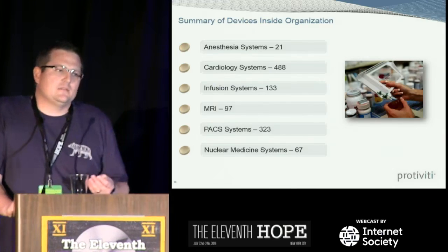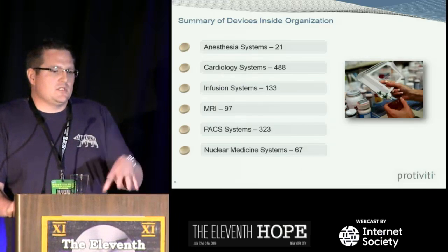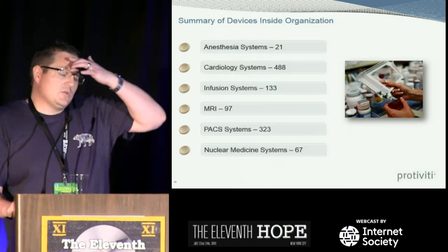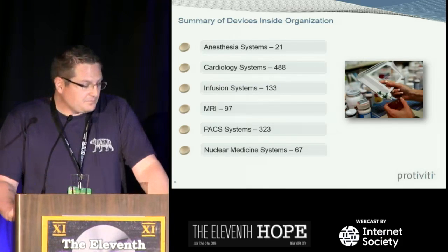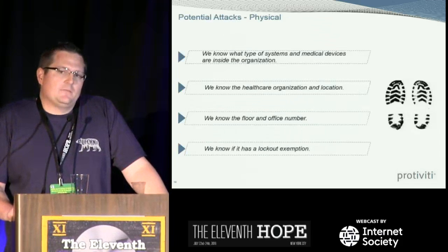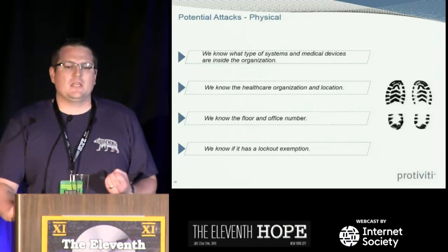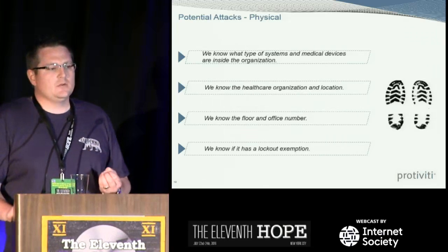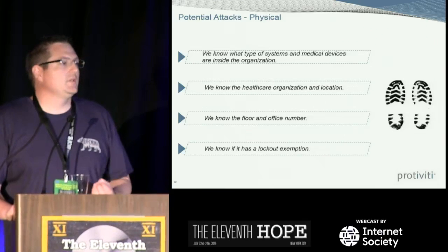And that is the back-end storage. When you take any of those radiology images, it stores them in PACS systems, which traditionally have very poor security around back-end storage. Outside of that, before I let Adam go on the attack perspective, one thing that was important, as I said in the beginning, was this was XP, right? It was an XP system with SMB open.